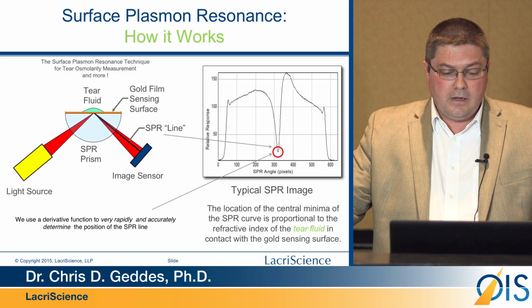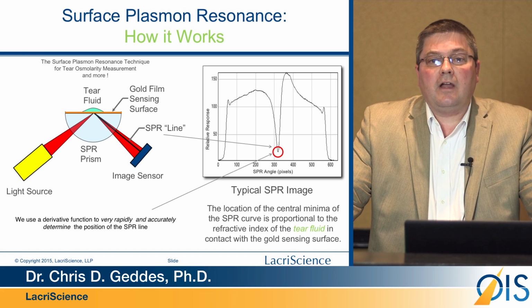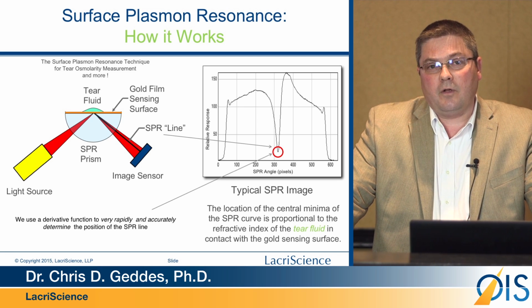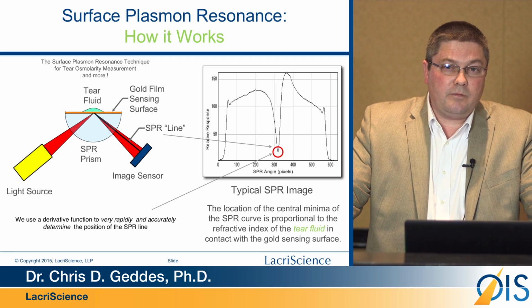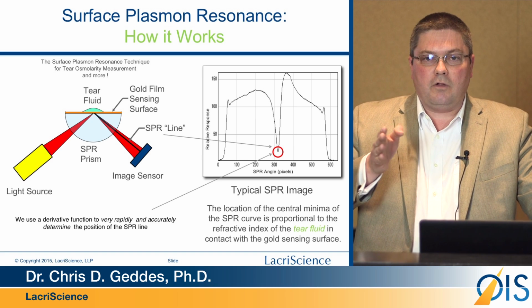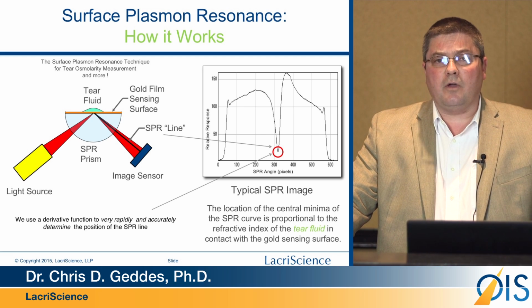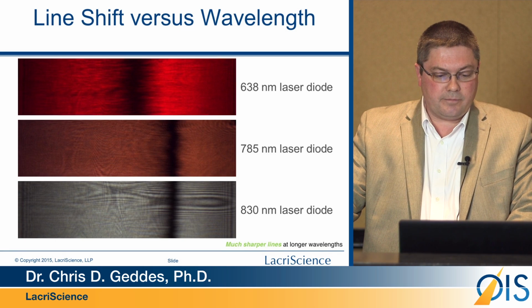The LacriPen works using the principle of surface plasmon resonance. And in a nutshell, a tiny gold film, when light impinges on the underside of it, generates an evanescent field on its top surface. When it's very close to a tear film, that evanescent field is perturbed and a little tiny black line will move as a function of the salt concentration, or effectively the change in the refractive index of the tear film. And that's how we're able to quantitate with very high accuracy osmolarity for dry eye syndrome.